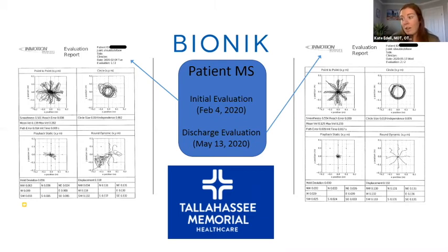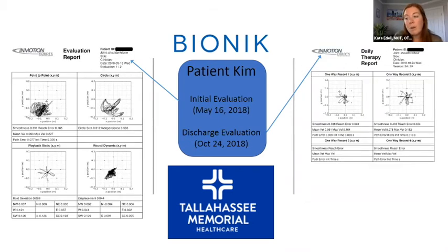I think you have another patient example for our next question, which is, what has been your patients' responses to using the InMotion ARM? How has the reporting system helped you communicate with them about their deficits? So patients, like I said, they get really excited because they get immediate scores. I think that's what is so motivating about the robot, is getting those immediate scores and wanting to be able to improve them. And like I said, it's so visually appealing that you don't have to know how to read the metrics. You're just able to look at it. And I think the patients really appreciate that.